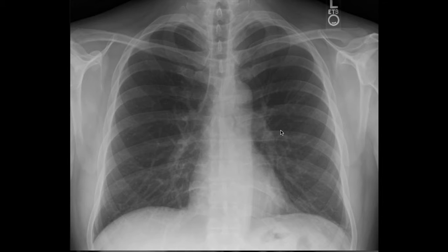You have COPD, chronic obstructive pulmonary disease. You have asthma. There's pleural disease that includes the pleural effusion. You have tuberculosis and asbestosis that goes under the family of occupational exposures. So this is a group of pathologies that we can see on a chest X-ray.